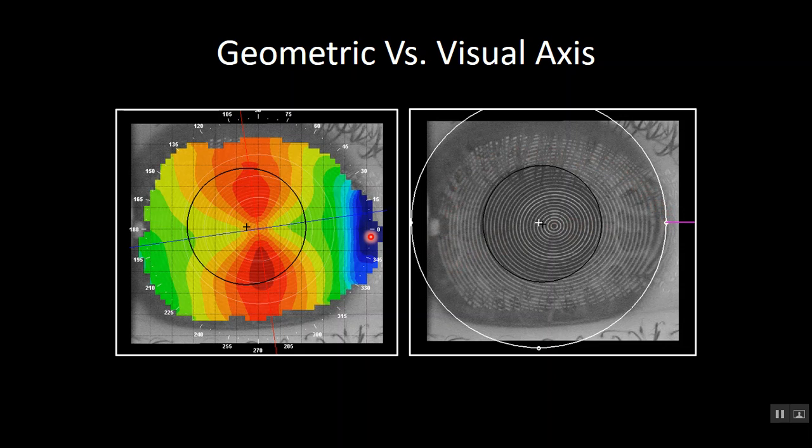And that gives you a topography with more blue on the nasal, less coverage of the visible iris on the temporal side. So we are seeing that temporally displaced fovea and how patients aren't being captured along their geometric axis. They're captured along the visual axis.